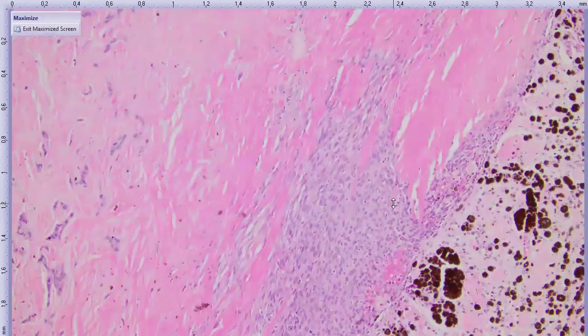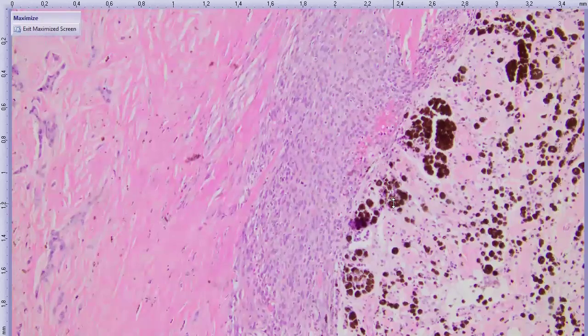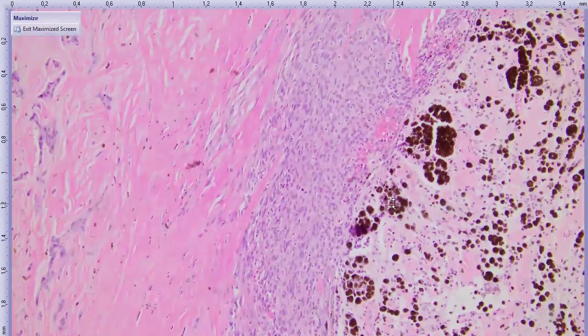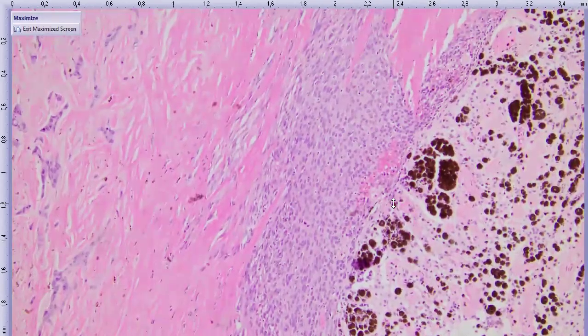Yeah, if there are any questions, just shout it out. There's just been a comment said so far they've considered 3 different tumors. Good. So I'm glad we are all on the same page. Sometimes all we need is to show a case to someone so we can all be confused together.